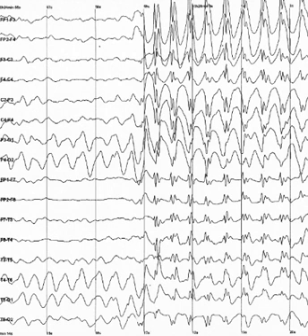Purposeful or reflexive eye blinking also generates electromyographic potentials, but more importantly there is reflexive movement of the eyeball during blinking that gives a characteristic artifactual appearance of the EEG. See Bell's phenomenon. Eyelid fluttering artifacts of a characteristic type were previously called kappa rhythm or kappa waves.